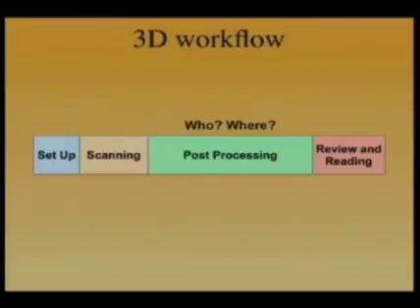And those are two important points in deciding on what an appropriate 3D workflow would be. Who's going to do it and where are they going to do it? There are a couple ways of approaching that, I think. One is what I call centralized post-processing, where you have, say, 4 scanning rooms, and in each room you do the setup and 3D volume acquisition that I just talked about.